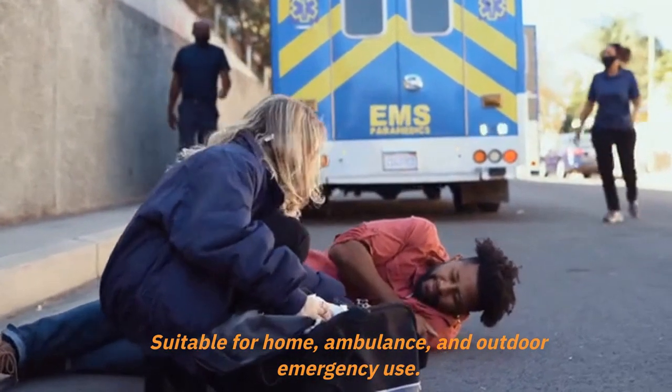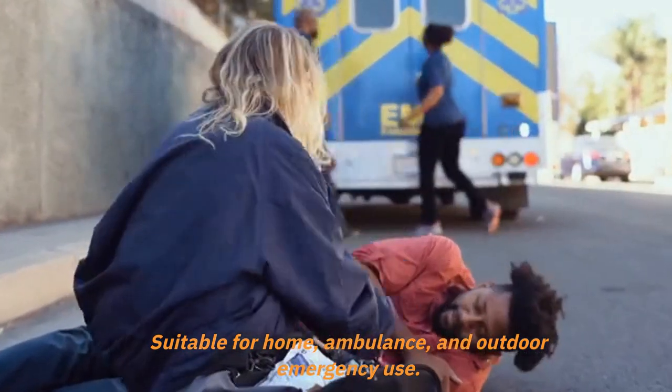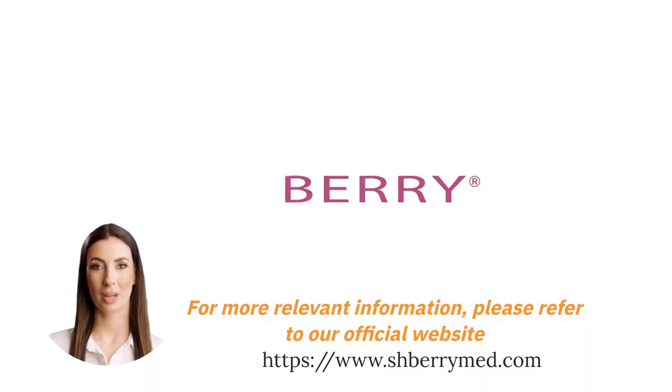Suitable for home, ambulance, and outdoor emergency use. For more relevant information, please refer to our official website.